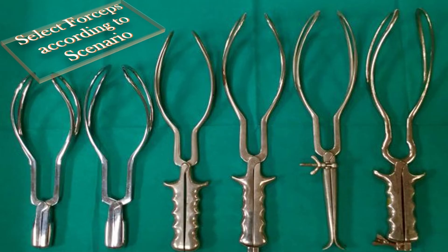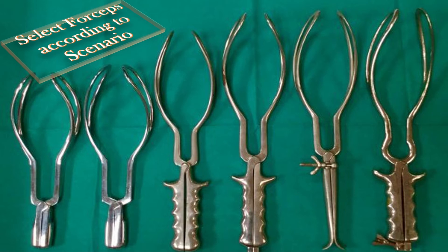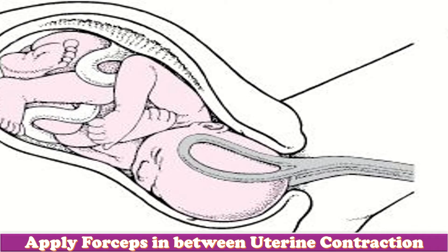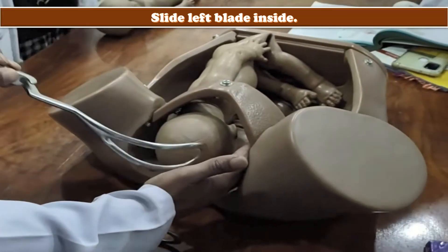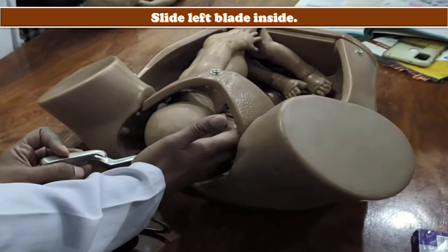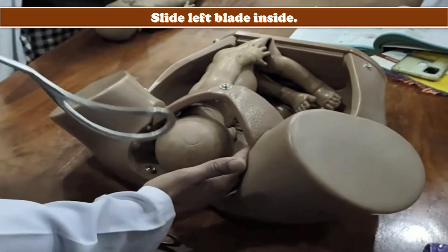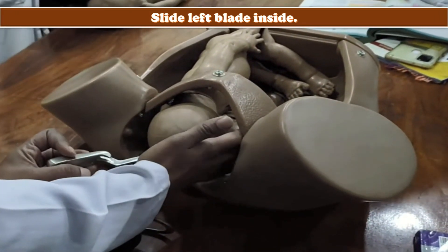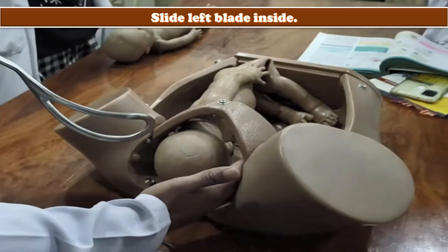I will select forceps according to the scenario and check that both pairs are of the same size, then assemble them in front of the maternal pelvis and articulate them. I will apply forceps between uterine contractions. First, I will apply the left blade — holding the left blade in my left hand so that it is hanging vertically with the handle next to the mother's right groin.